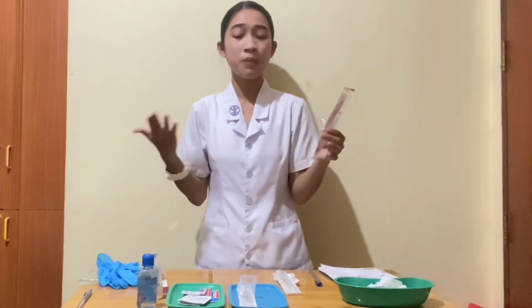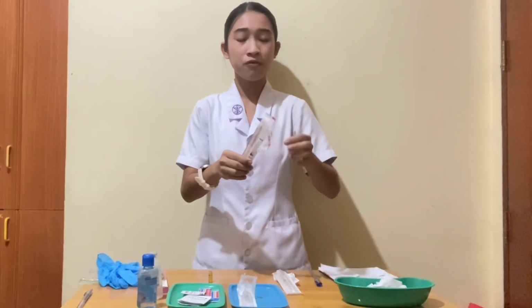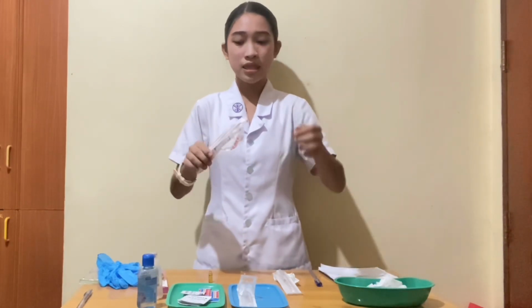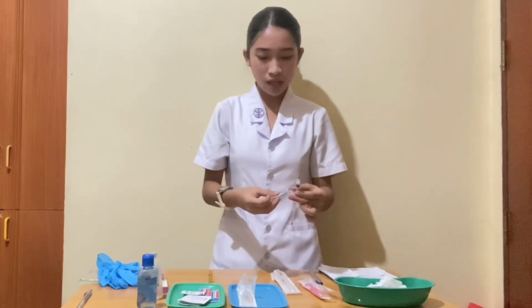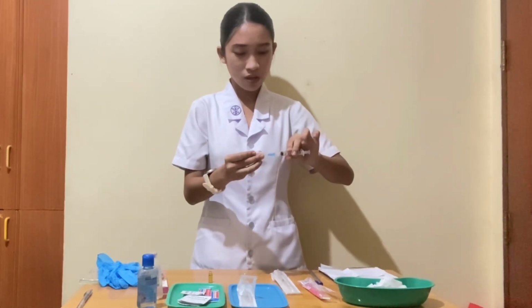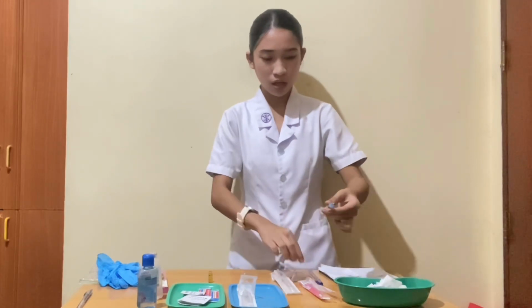So now we need to withdraw the medication. First, place the ampule on a flat surface, then attach the filter needle to the syringe to prevent glass particles from being withdrawn into the medication, and remove this cap again. Now I'm going to attach the aspirating needle by opening this one. Firmly attach this aspirating needle, then open the cap like this to avoid pricking.